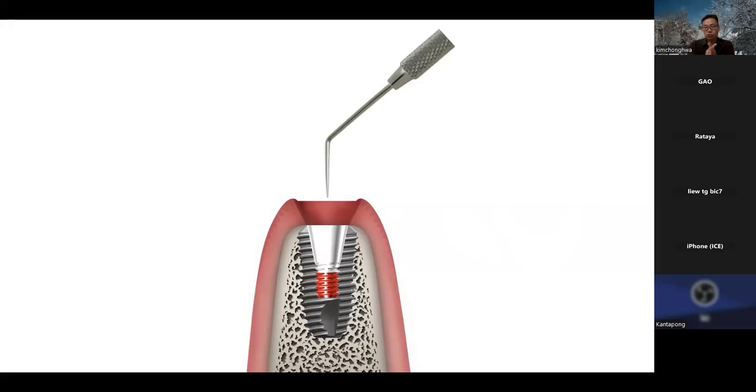instrument pretty much with a very sharp point, very sharp, long, pointy end, like an Explorer or endodontic Explorer. This point end can catch the irregular surface of the top portion of the broken screw, and it can easily rotate the screw out with counterclockwise motion.